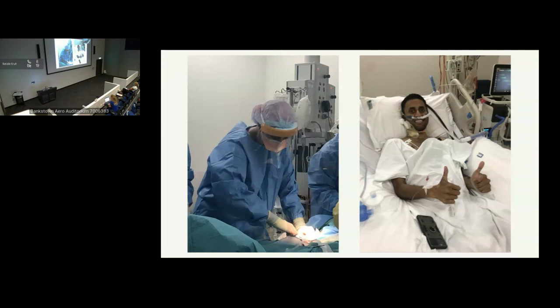So we cannulated him awake, and that allowed his oxygenation to stabilise. And he received chest physio on ECMO awake, and that led him to only be on ECMO for 10 days, and he's back home now working and with his kids.